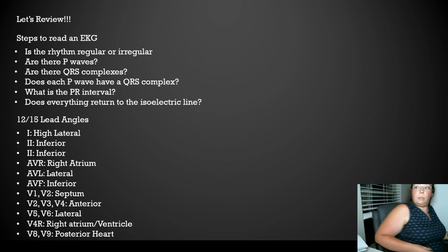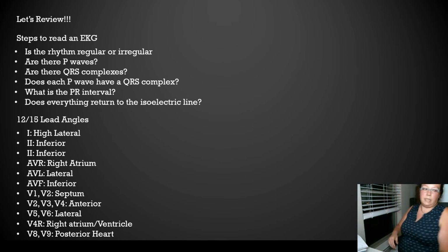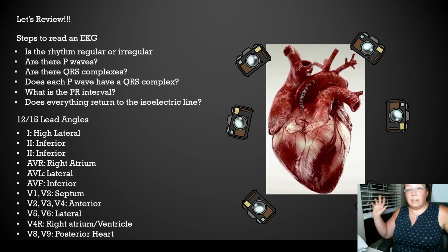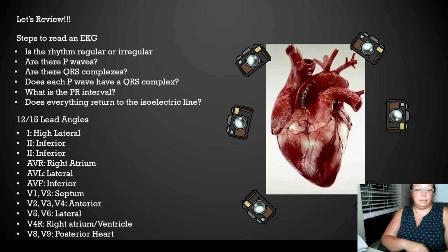And then we've got the posterior, which I don't know if I can show you. Let's see if I can. It's going to be back here. We're going to look at the posterior part of the heart, V8 and V9. Paparazzi. The heart has all these different angles that it's getting pictures taken. So the heart has its paparazzi of the 12 lead and 15 lead.